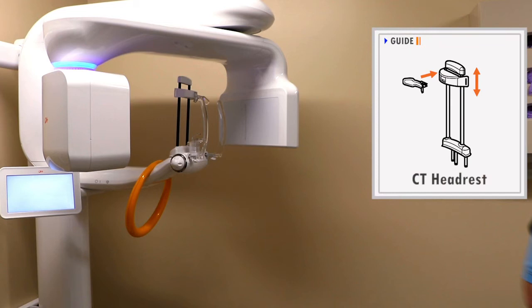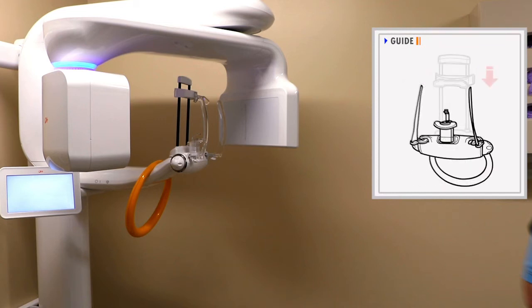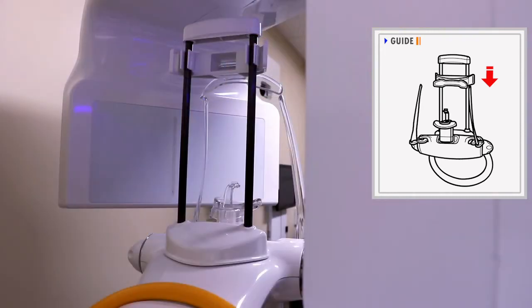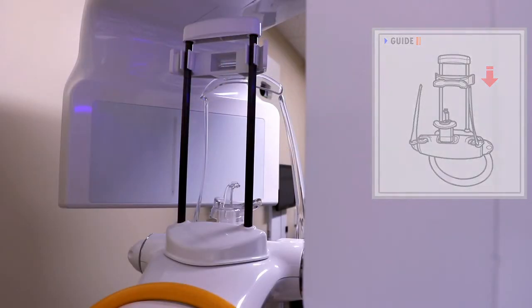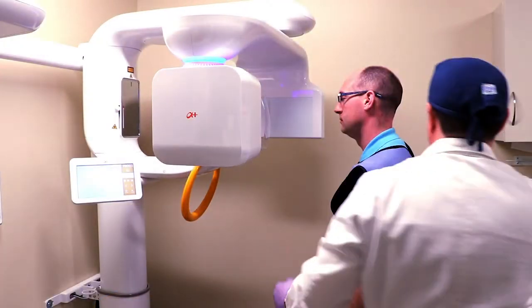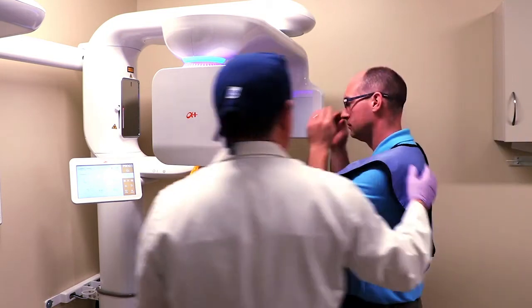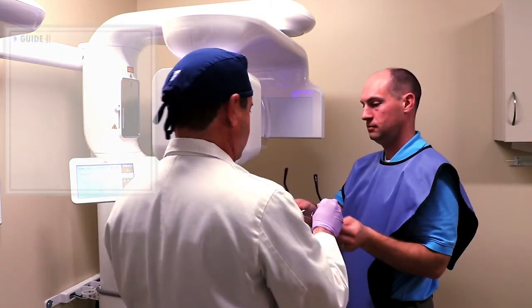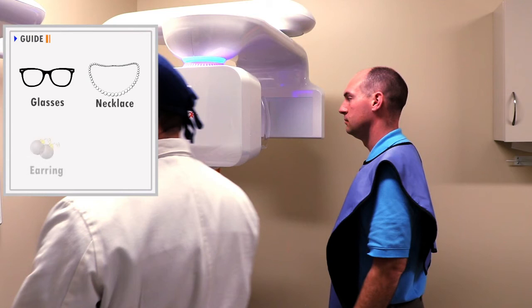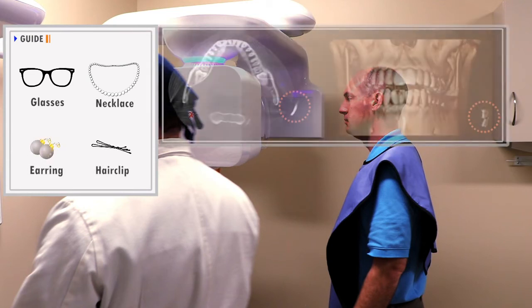Prepare the CT headrest, then insert it on the handle frame. Assist the patient to appropriately wear the lead apron. All jewelry and metallic objects such as eyeglasses, necklaces, earrings, and hair clips should be removed.